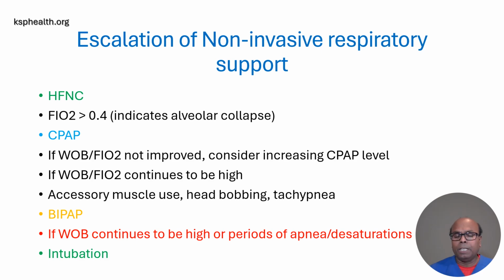From our experience, do it right from early on using high flow nasal cannula or CPAP, BiPAP. Both can be done through the RAM cannula. You can avoid intubation in the vast majority of patients. Yes, there is a subgroup of patients who definitely need to be intubated and cared for, but the vast majority can be easily dealt with high flow nasal cannula and RAM cannula ventilation.